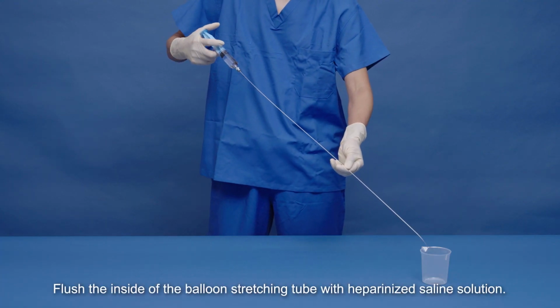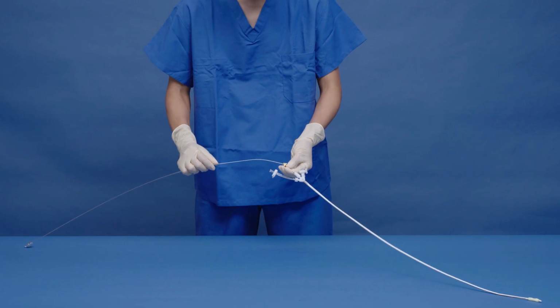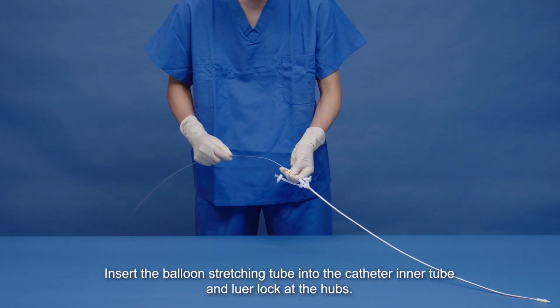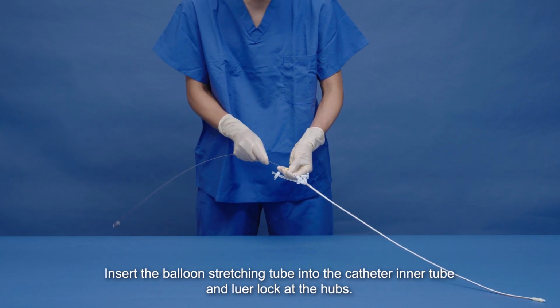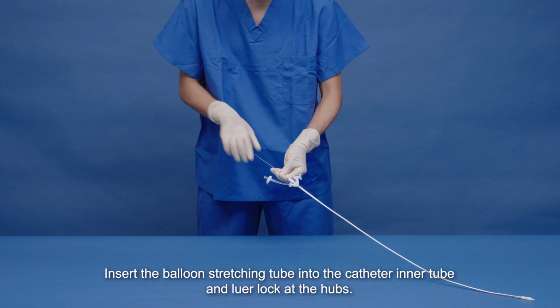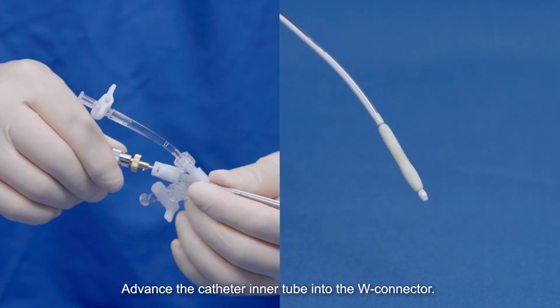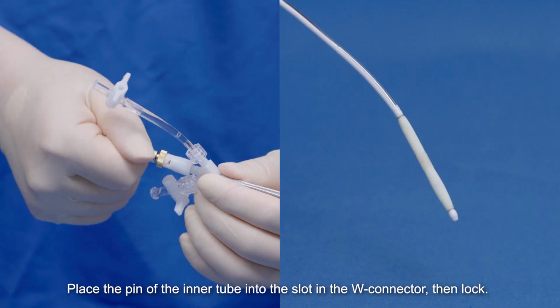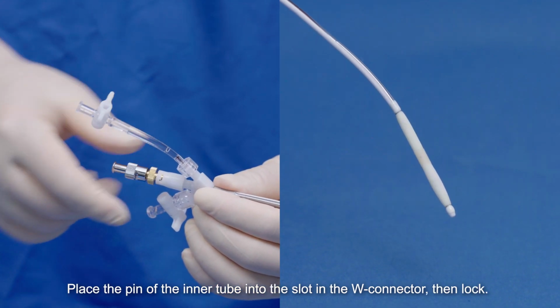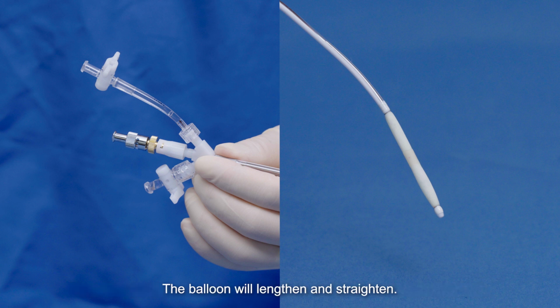Flush the inside of the balloon stretching tube with heparinized saline solution. Insert the balloon stretching tube into the catheter inner tube and luer lock at the hubs. Advance the catheter inner tube into the W connector. Place the pin of the inner tube into the slot in the W connector, then lock. The balloon will lengthen and straighten.